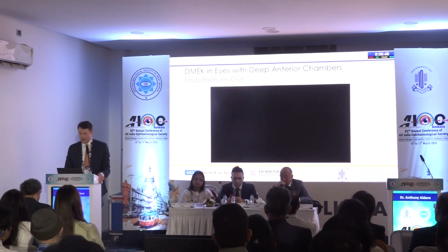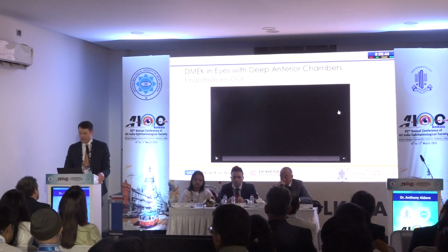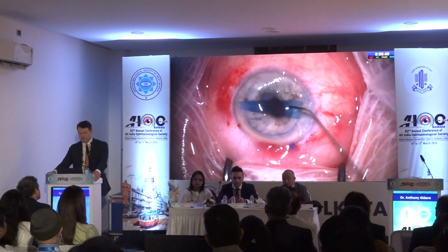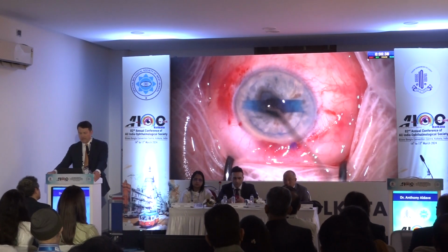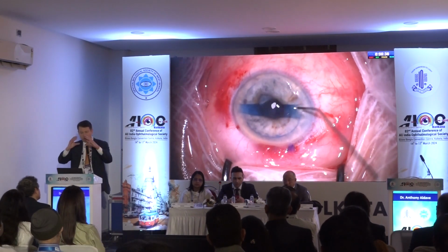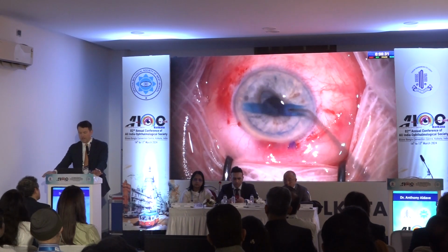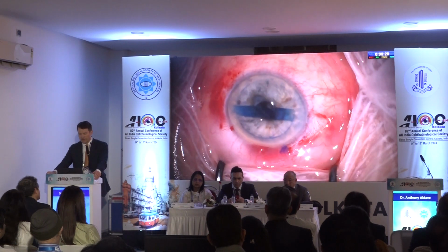Here's another endo out case. This case, no trab, but deep anterior chamber. Post-vitrectomy, high myope. And again, I am struggling to get this out of a tubular configuration and try to make it flat. Doing everything I can, I'm tapping on it. I've removed as much aqueous as I can.